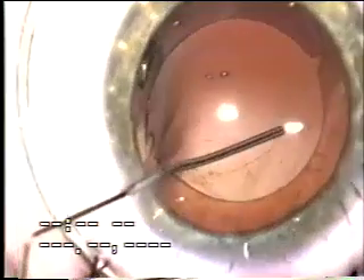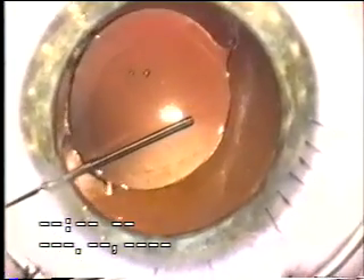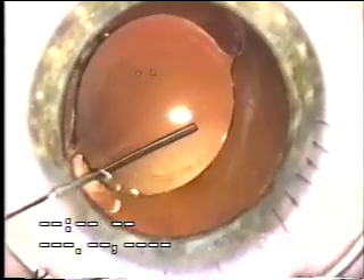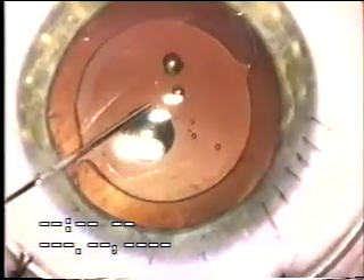This technique was used in a case of a retinoblastoma-treated eye with secondary cataract. Again, no vitrectomy was required, which made the oncologist happy. You can see the capture, and this eye has maintained a clear visual axis since that time.